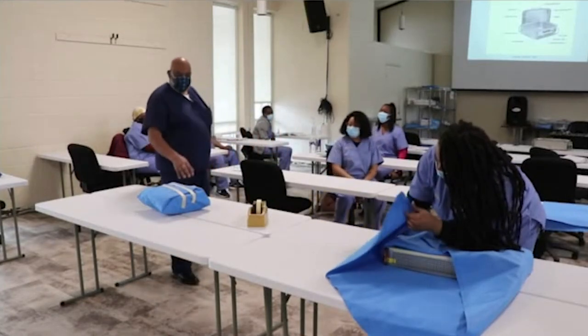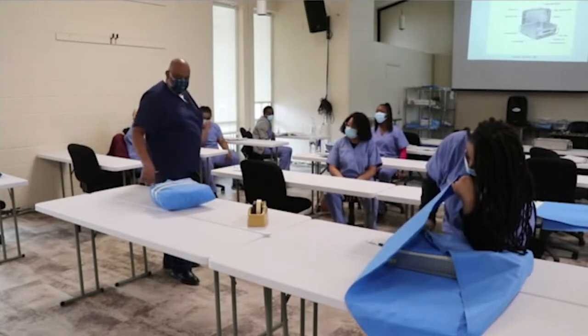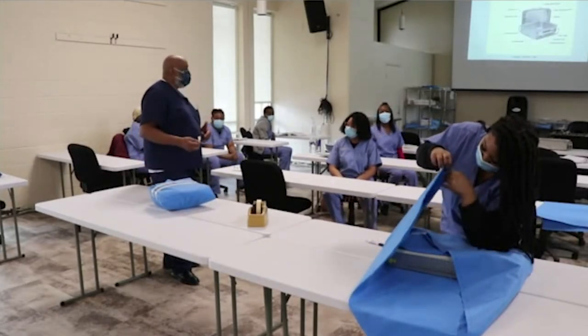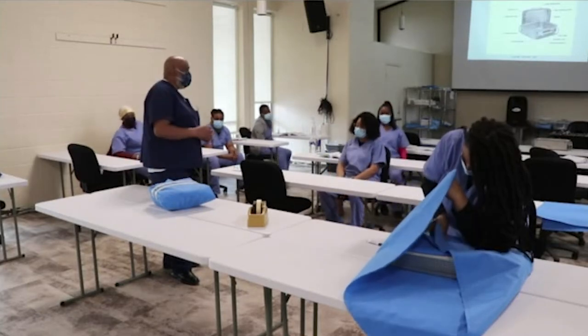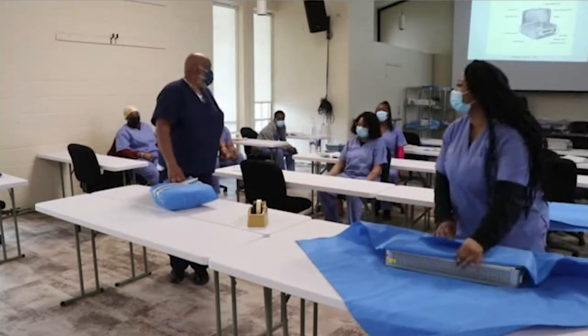This is good. Now, what's the key to how we open it? Everything that we wrap is open for the field. Remember that. They have to be able to open it aseptically in the field. They don't want to fight with it. You want to wrap, Jermaine?